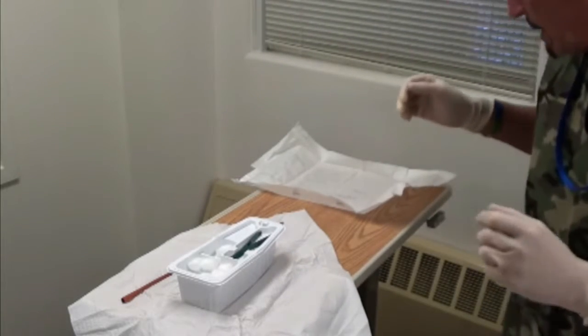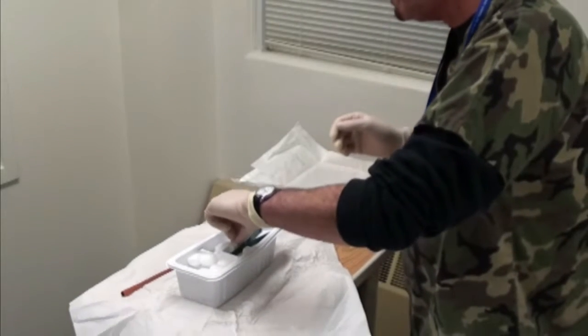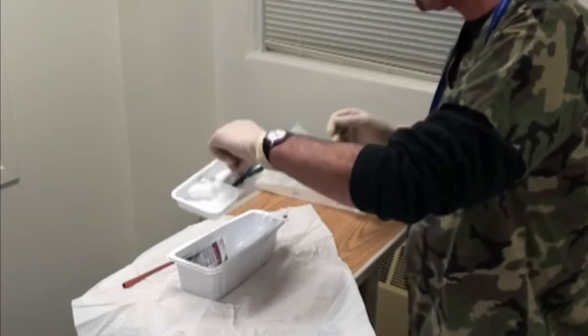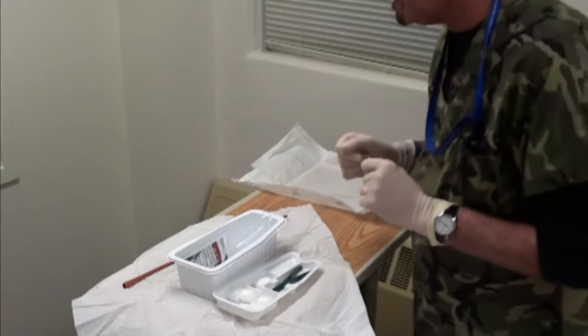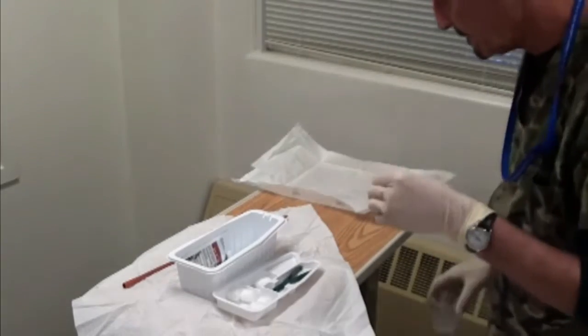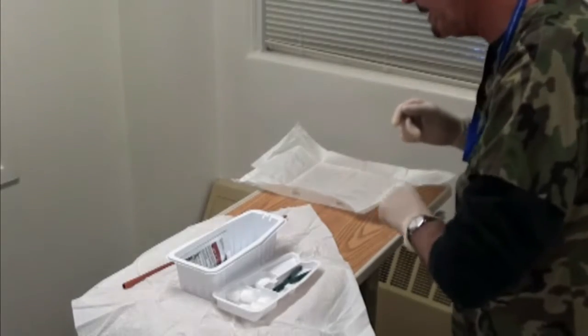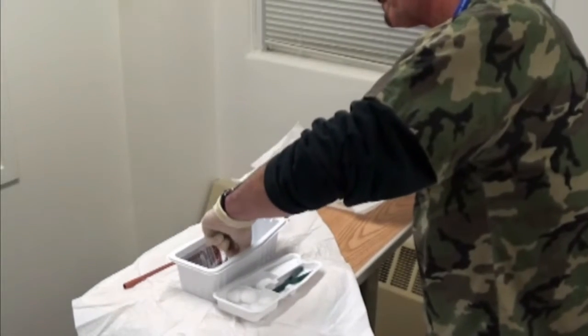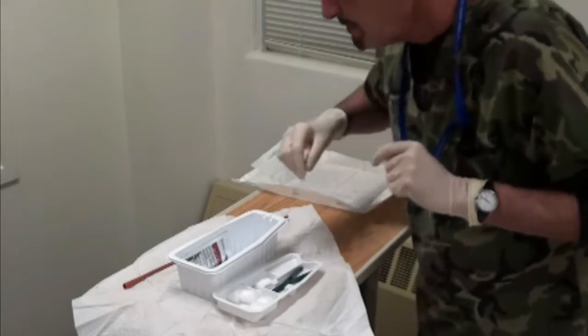Now coming over to my tray, I'm going to remove the packet. I'm also going to remove the contents I do not need: the specimen cup, lid, and the syringe if it was a Foley.